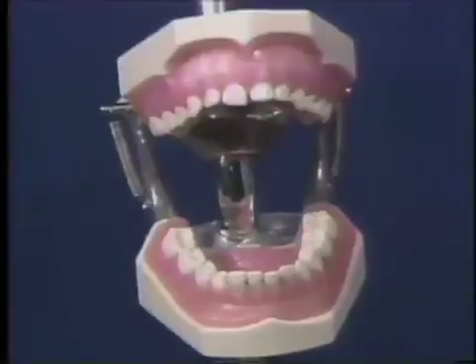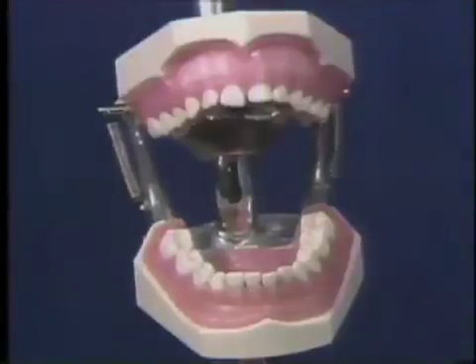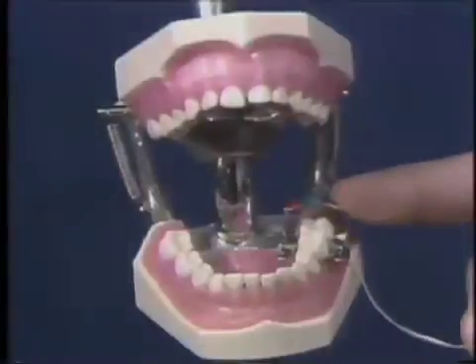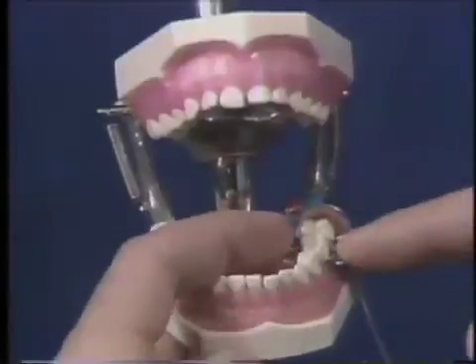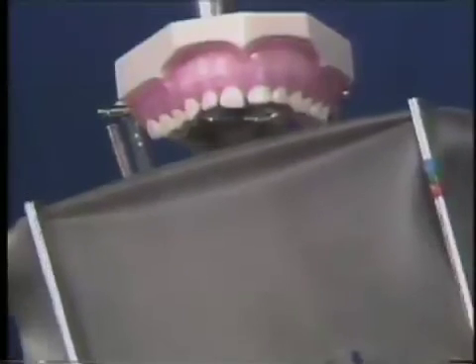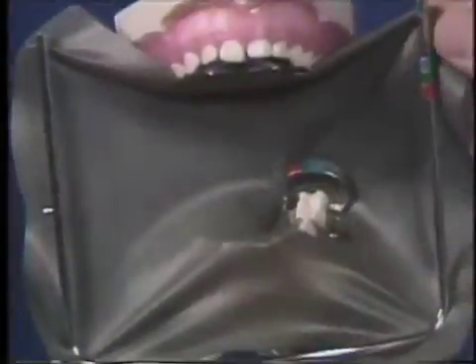The second method for placing the rubber dam differs in these first steps only. In the second method, the rubber dam clamp is placed first and the rubber dam and frame is placed as a unit over the clamp. Seat the clamp on the tooth — in this case a number 14 clamp on tooth K. Make sure that the dental floss tied on the clamp is outside the mouth. Check as before to see that the clamp is stable on the tooth. Now attach the rubber dam on the frame loosely on the four corners. In a single motion, stretch the rubber dam anteriorly so that it snaps over the clamp. At this stage the rubber dam should be tightly adapted around the clamp tooth.